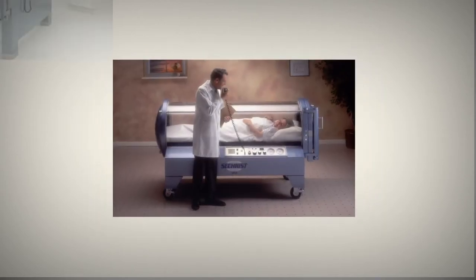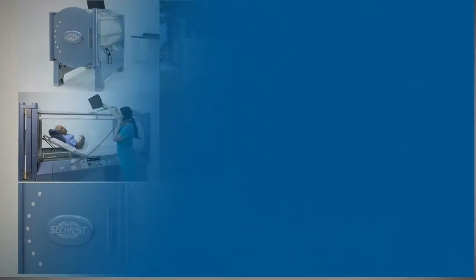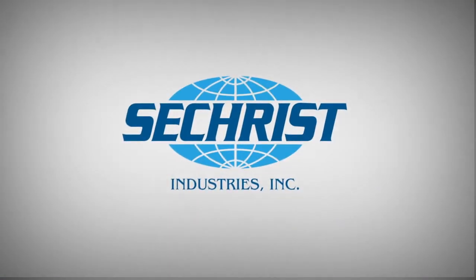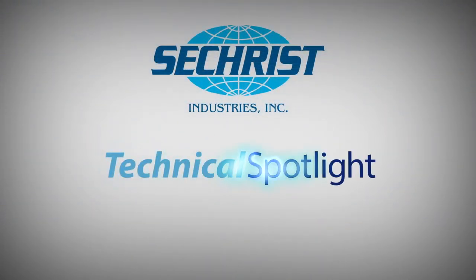Welcome to Sechrist Technical Spotlight, where we show you specific how-to instructions to help with patient care and the simple use of our innovative products. As always, if you are unsure of how to perform any of these tasks, please consult with one of our professionally trained field service technicians.